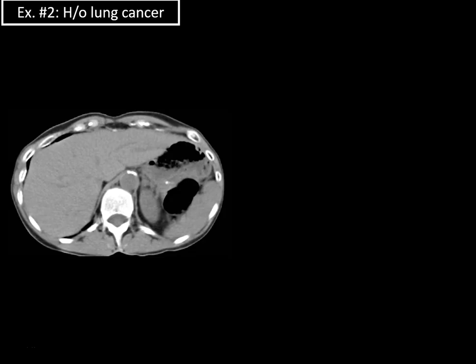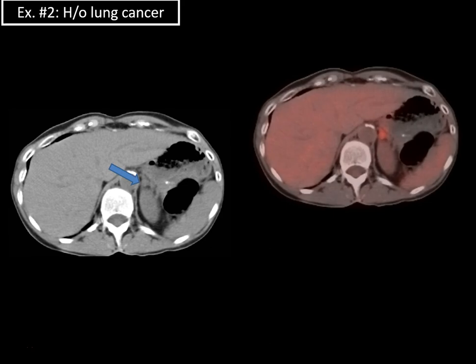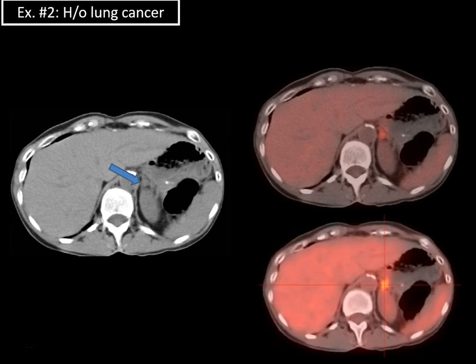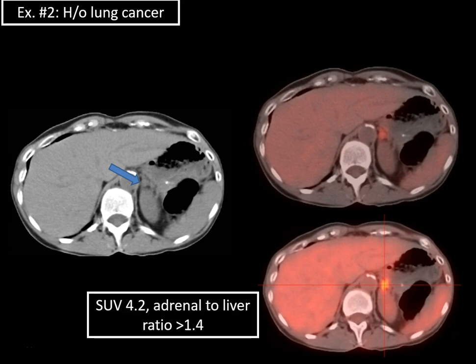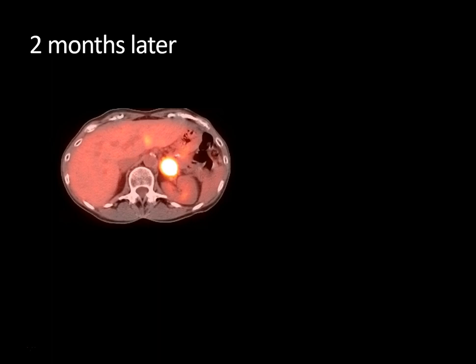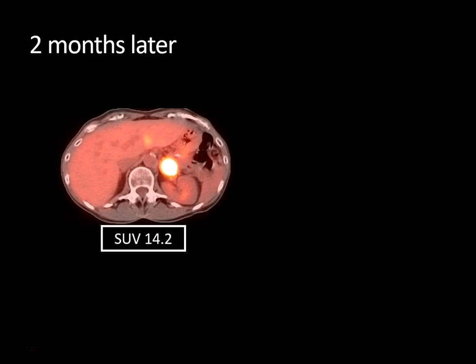Here's a patient with a known history of lung cancer. On non-contrast CT, there's a left adrenal nodule. On the PET data fused to that CT scan, this nodule is avid and visually looks more avid than the liver. Measuring the SUV value gives a maximum SUV of 4.2, and the adrenal-to-liver ratio was greater than 1.4 — extremely suspicious for a metastatic focus. On a follow-up PET CT only two months later, this mass had increased significantly in size and avidity, now with a maximum SUV of 14.2.